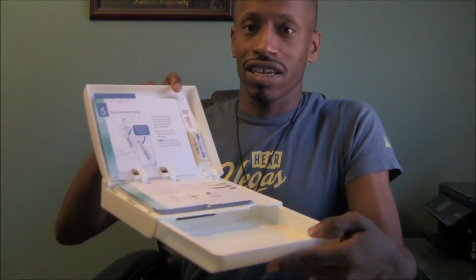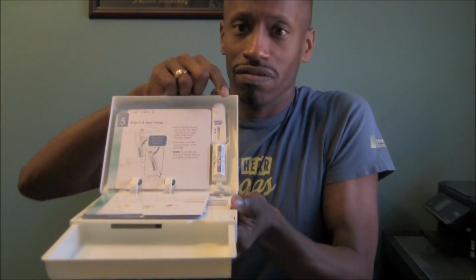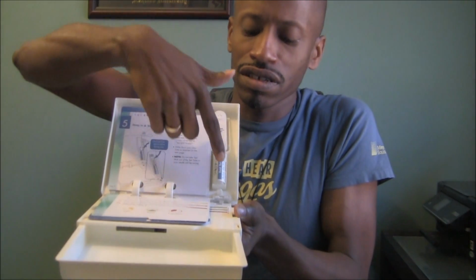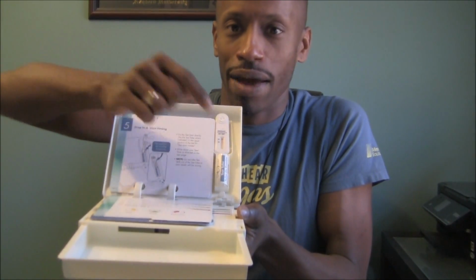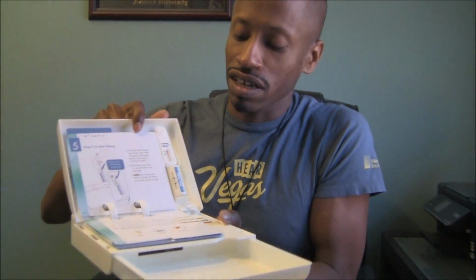It's kind of like it takes the test and you put the little solution here and then you put the test strip inside the solution. The solution is snapped in, so I can't really do anything. I have to wait and wait and wait. This is almost like the first time I took the test and I found out I was positive. But it's interesting to look at this. It's interesting how far advanced we've come.